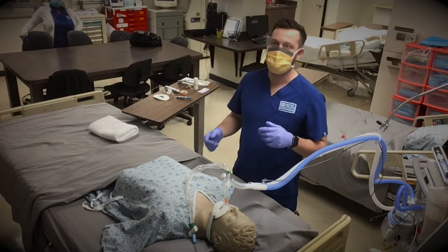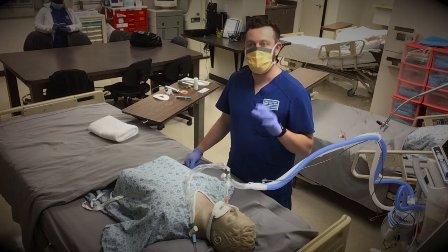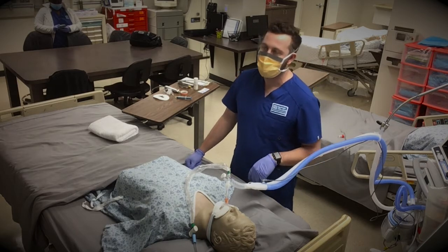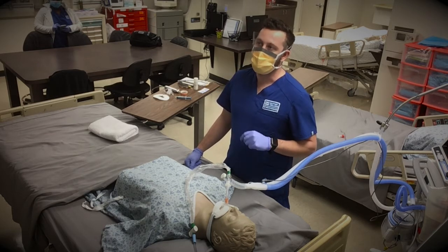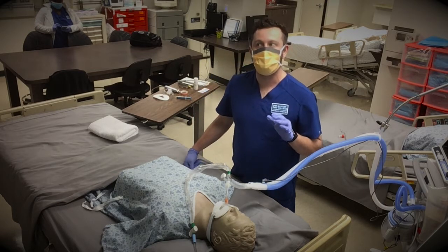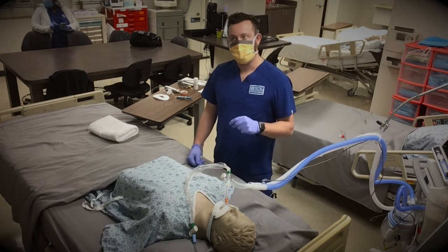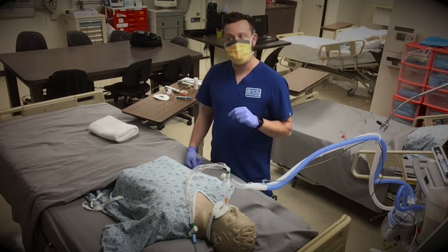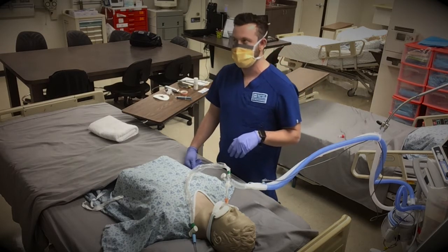The endotracheal tube should be removed in an environment in which emergency equipment and appropriately trained healthcare providers with airway management skills are immediately available to assist with the patient. Some indications for the removal of an endotracheal tube: the airway control afforded by the endotracheal tube is deemed to be no longer necessary for the continued care of the patient. Some subjective or objective determination of improvement of the underlying condition impairing the pulmonary function, gas exchange capacity, or both is made before extubation.